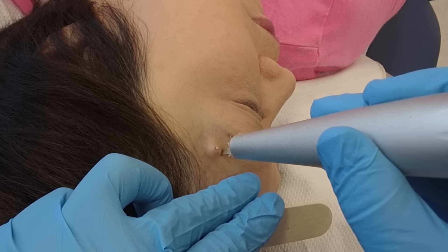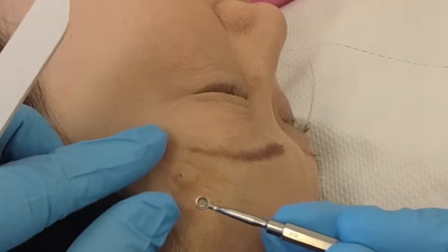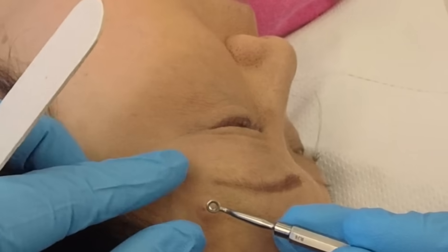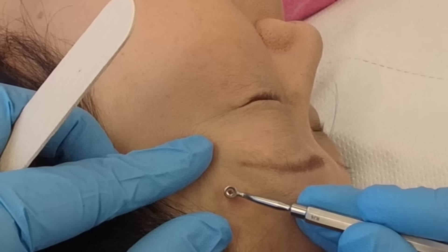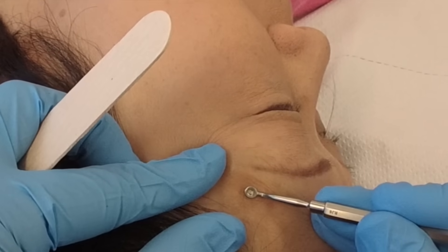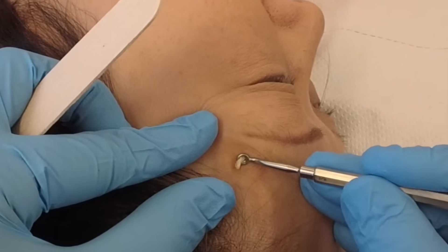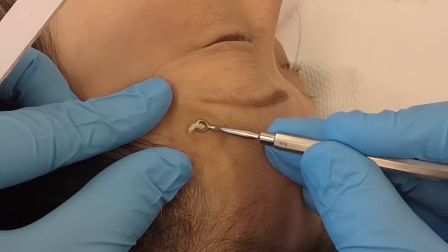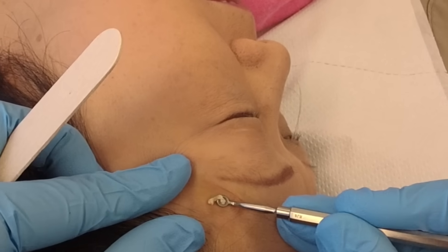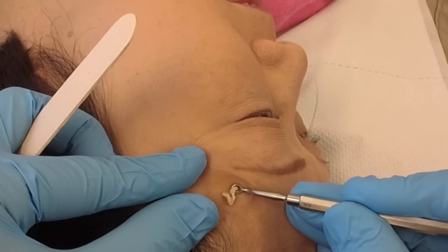This causes very little damage to the surrounding tissue. It's virtually painless — I put local numbing cream beforehand. Now I'm using an extractor. There are different types of comedone extractors; I'm using a cup extractor, shaped like a cup. I'm putting pressure on it, rocking back and forth, and I can't believe how much content is actually coming out of this dilated pore.